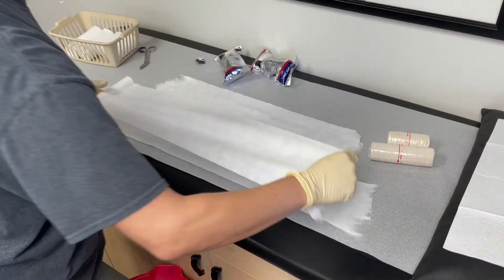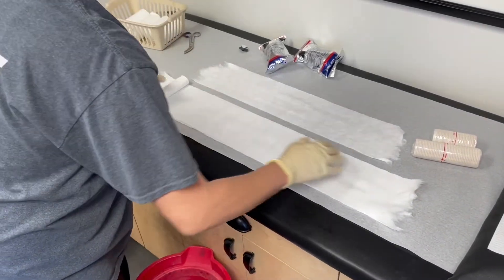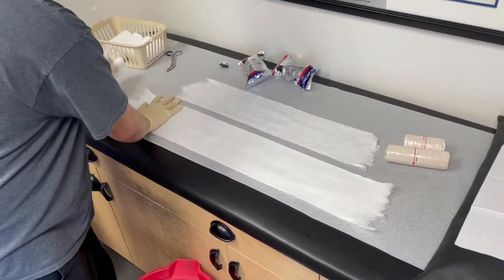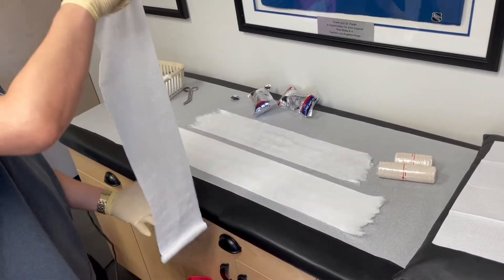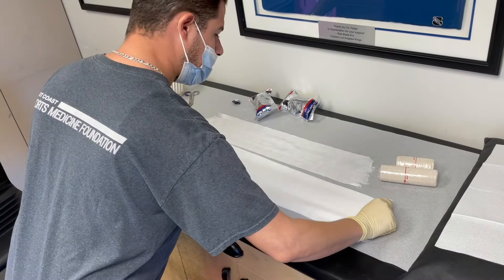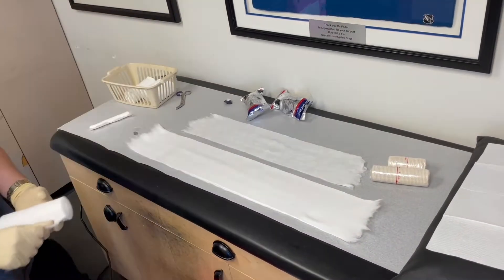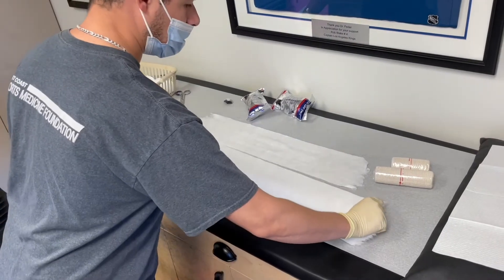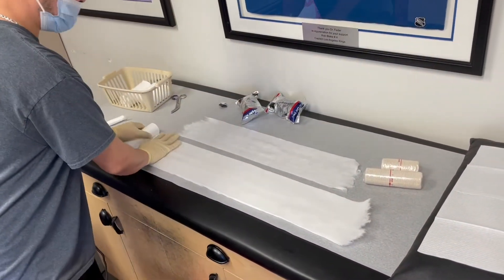This is important because you want to make sure the ends of the splint are cushioned, especially if it's going to be near the axilla. We will put about eight layers of padding here.